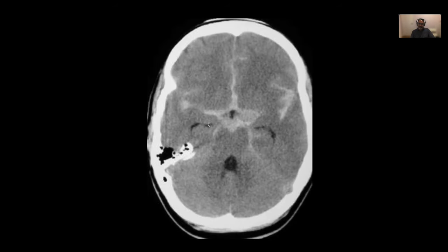All right, and this one, subarachnoid, diffuse bleeding in different compartments of the brain.